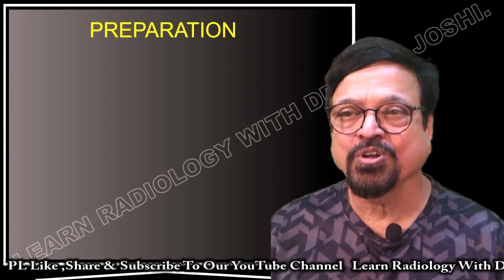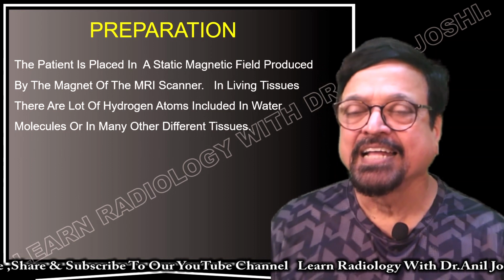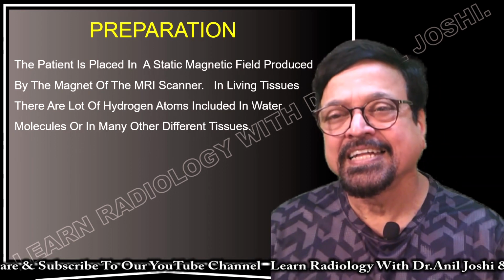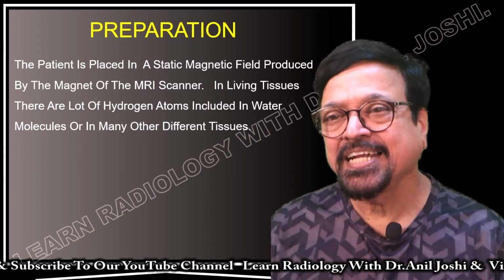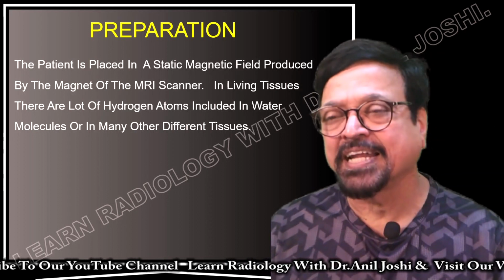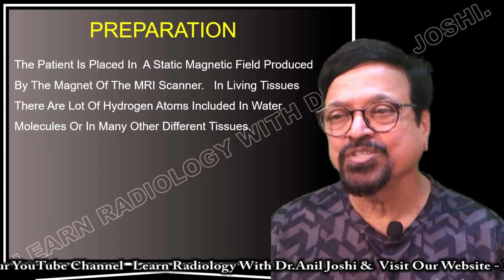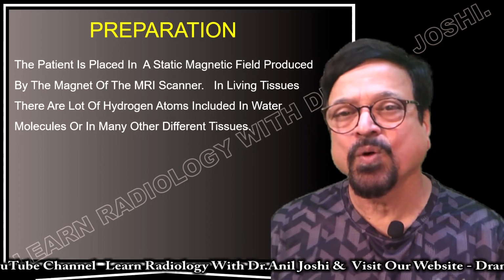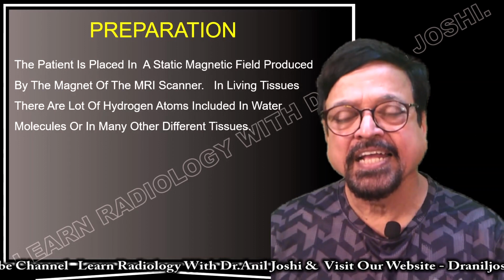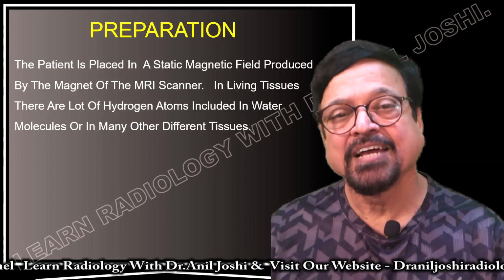Let's come to the first topic, that is the preparation. The patient is placed in a static magnetic field produced by the magnet of the MRI scanner. In living tissues, there are a lot of hydrogen atoms included in water molecules, and water is abundant in the body. The human body has more than 75% water.